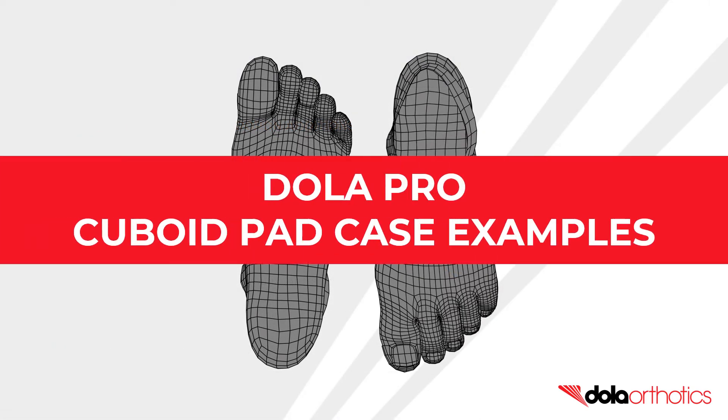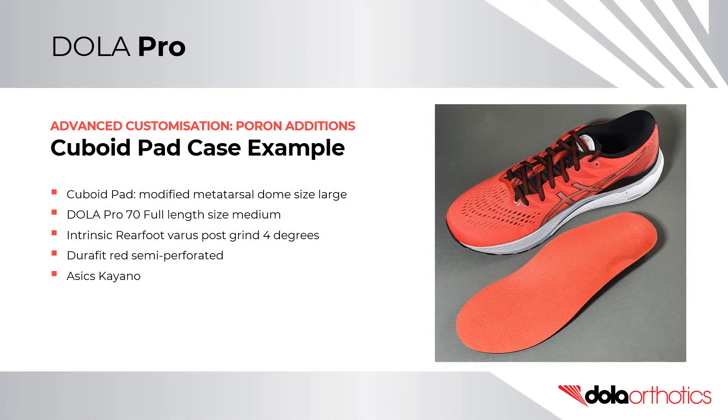Cuboid Pad Case Examples. In this case example, a size large Poron metatarsal dome was modified for a cuboid pad and was placed on a size medium DollarPro 70 soft full length orthotic shell. The prescription was completed with a 4 degree varus intrinsic rearfoot post grind, semi-perforated Durafit red top cover, and fit customizations for the Asics Kayano 28s.